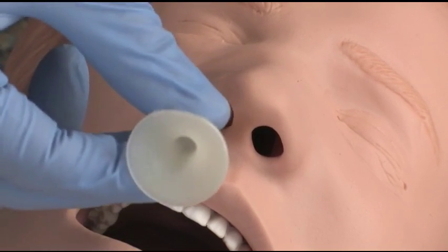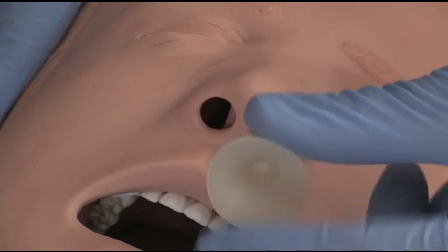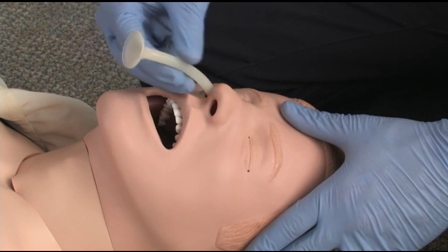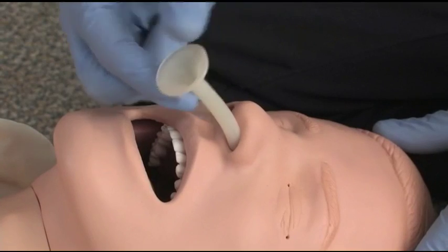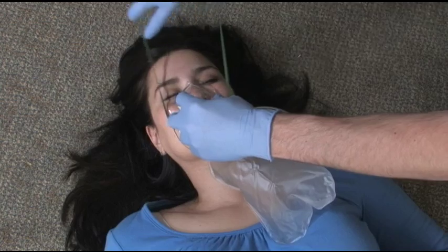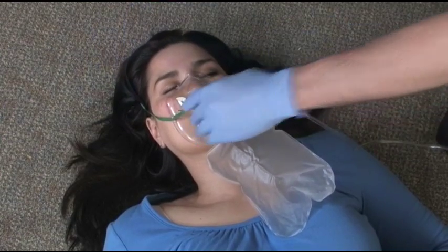If you meet resistance, remove the airway. Apply more lubrication if needed, and try inserting it into the other nostril. If the patient begins to gag at any stage in this procedure, immediately stop advancing the airway and remove it. Stop advancing the airway when the proximal ring has come in contact with the nostril. Assess the patient's breathing. Apply supplemental oxygen or begin ventilations as necessary.